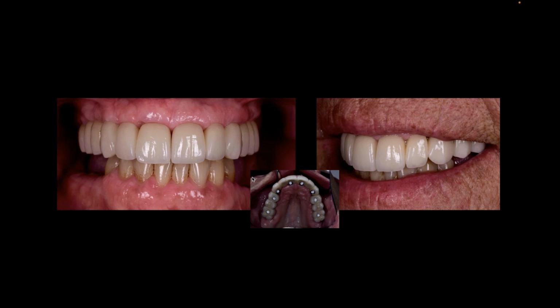The burrs break, something goes wrong. It's 40-50 minutes each time I fire that, right? That's a long process case to get to the end. And then if something goes wrong, all that has to start over again. So I definitely transitioned a little bit more to using Toronto type bridges with denture setups if I can.